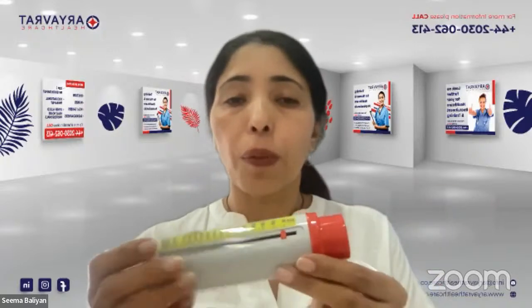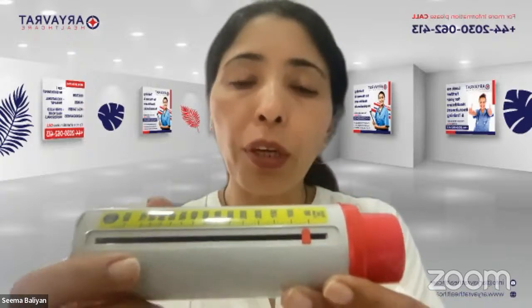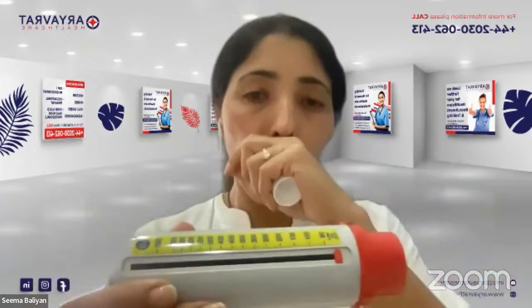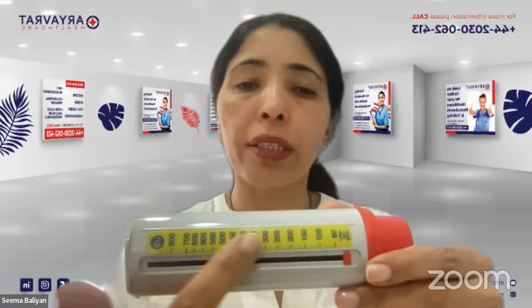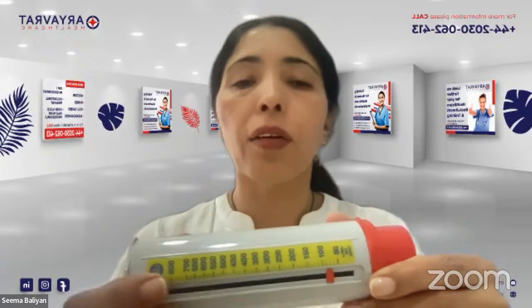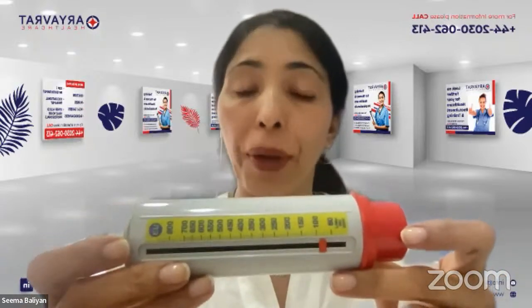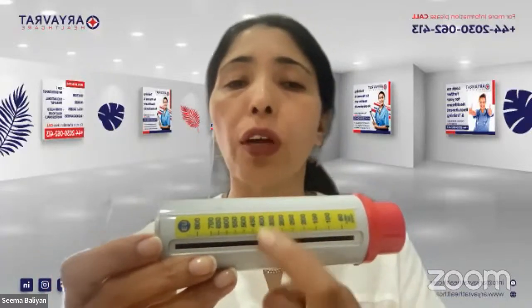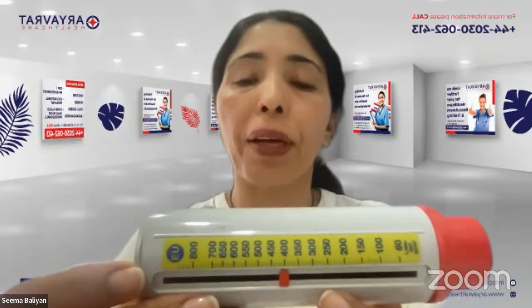Then there is the body of the peak flow, and in the body you can see this red colored plunger and this white and yellow scale. The scale is where all of the readings are, which you are going to be noting down as your lung capacity. And the plunger is the one which will move and point to one of the readings, indicating your lung capacity.